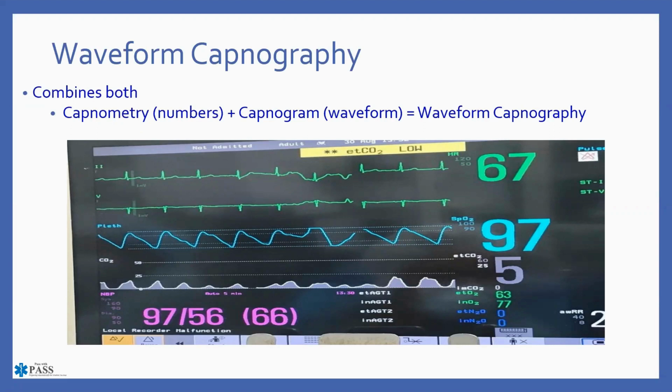And this really is the true class 1 indication or recommendation from the American Heart Association, primarily if you have a patient with a secured airway, we've intubated that individual, and so on and so forth, and we really need to be using waveform capnography. It still amazes me that pre-hospital care is so far ahead of the curve in a lot of this, but in the hospital setting, they haven't really caught up to that point. I do think that they're getting better about using capnography, and certainly the respiratory therapists and probably most of your emergency medicine physicians are aware of this.